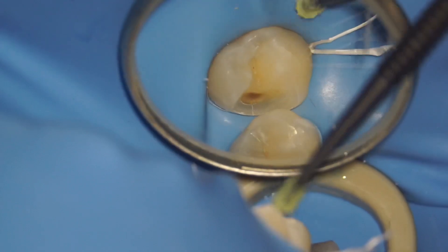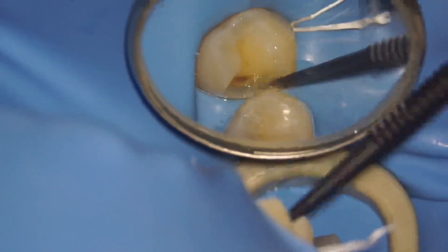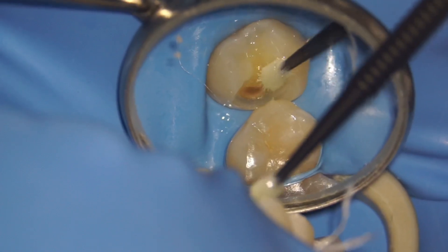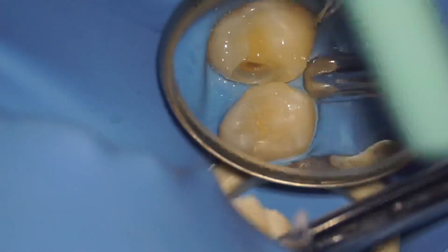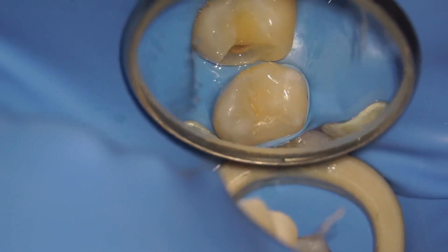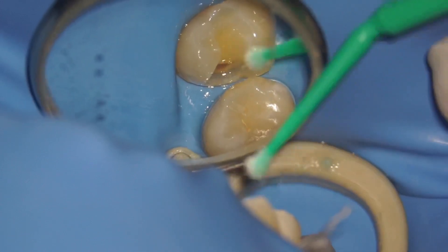As usual, I'm going to total etch the tooth. As I'm using a fourth-generation bonding agent, it is better to total etch and remove any dentinal debris. The first step is priming; the second step is adhesive. For the adhesive, I will also use a new micro brush to remove any pooling adhesive — I'm just wicking it away.